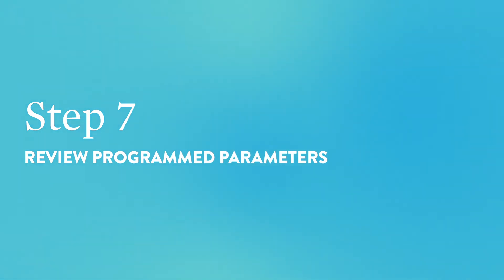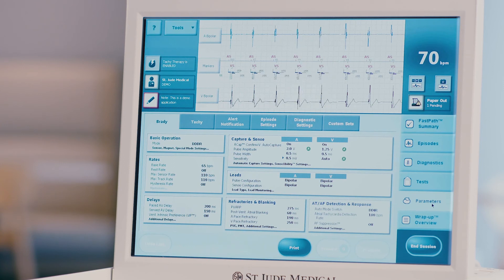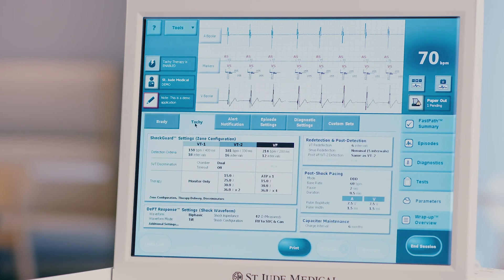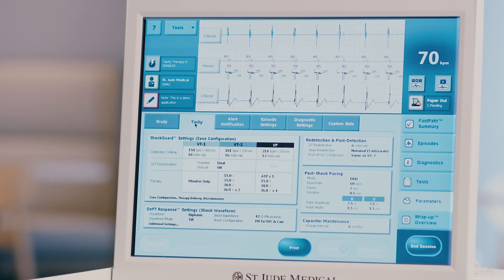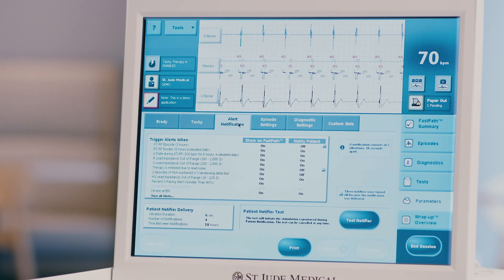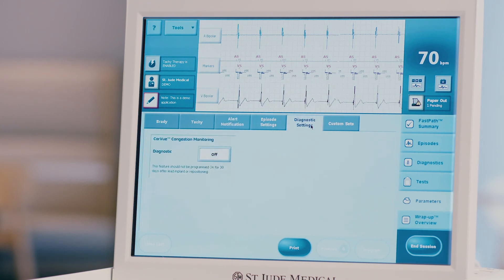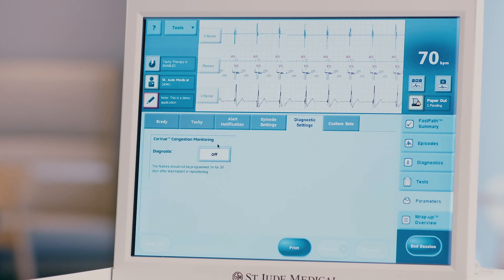Step 7: Review programmed parameters. Press the parameters tab on the right-hand side of the screen. The Brady tab will appear first, where all pacing parameters can be viewed or changed. Press the tachy tab to view or change all tachycardia detection and treatment parameters. Press the alert notification tab to review the programmed settings for FastPath summary alerts and patient notification alerts. Press the diagnostic setting tab to review or change the programmed settings for CorVue thoracic impedance monitoring.